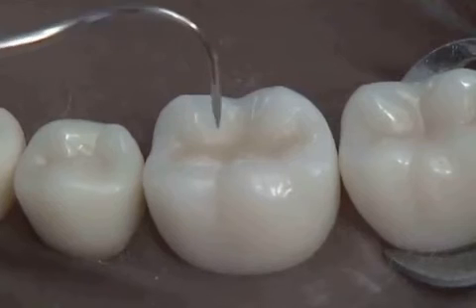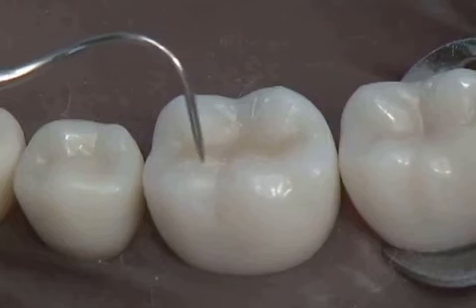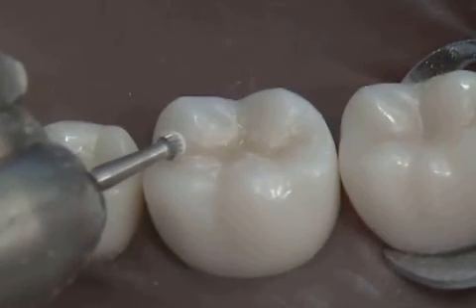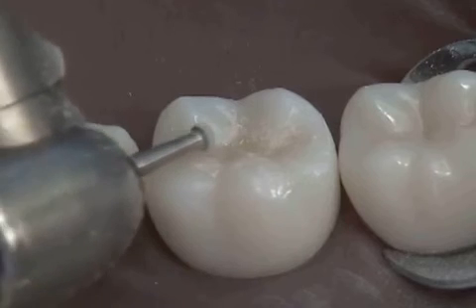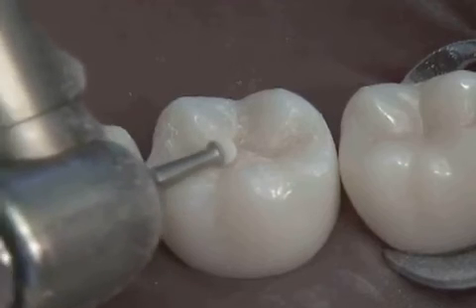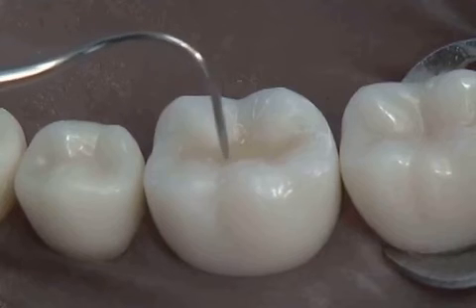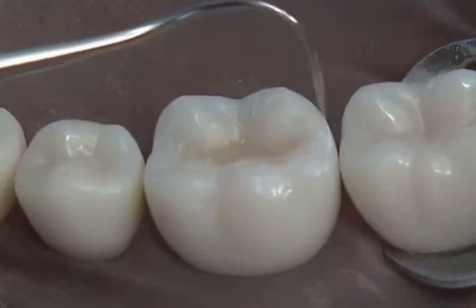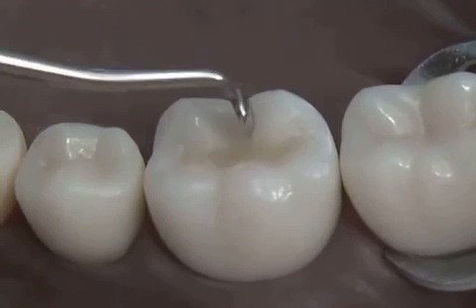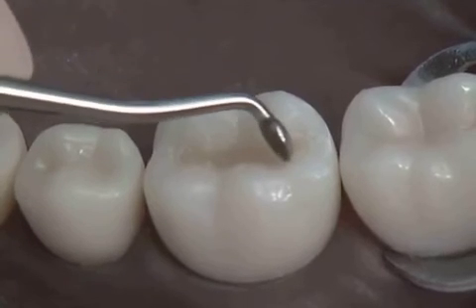Check with an explorer from tooth to restorative material to look for any presence of flash or composite material that snuck up and onto the unprepared enamel surface. If the explorer catches anywhere, you can remove this flash with the finishing burr. You can also remove flash manually with a cleoid-discoid hand instrument used along the cavosurface margin.